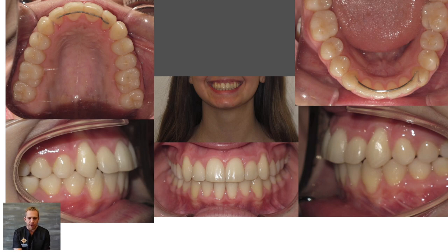These are the after photos. You can see how nicely that expanded the upper arch, widened out the smile, and filled it in a lot better. It looks much more full. We were able to get those teeth entirely widened out — wider than the bottom teeth. We also fixed the anterior crossbite just using braces, bringing that tooth forward to get it out of the crossbite relationship. We placed top and bottom permanent retainers, because with significant crowding this helps make sure those teeth stay where we put them, especially that tooth that was in crossbite, which has a tendency to want to move back.